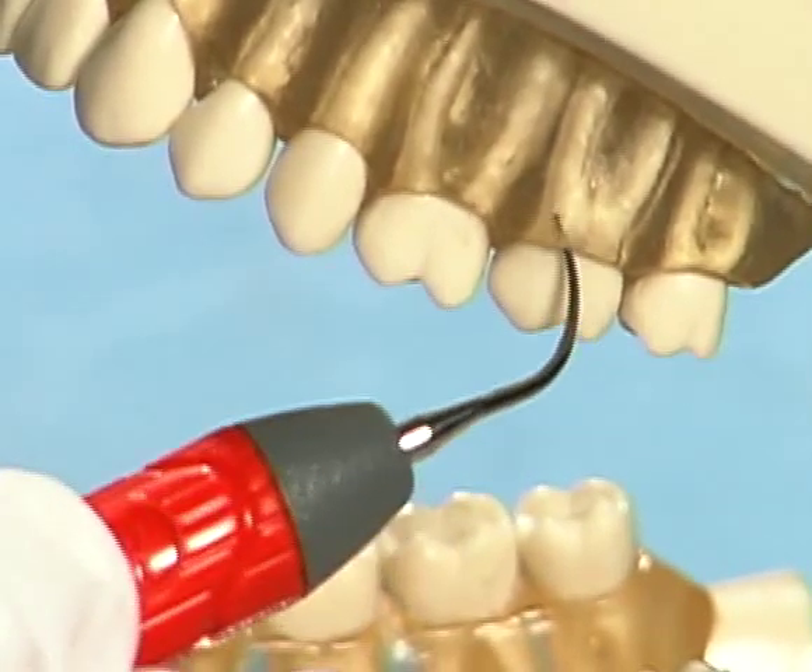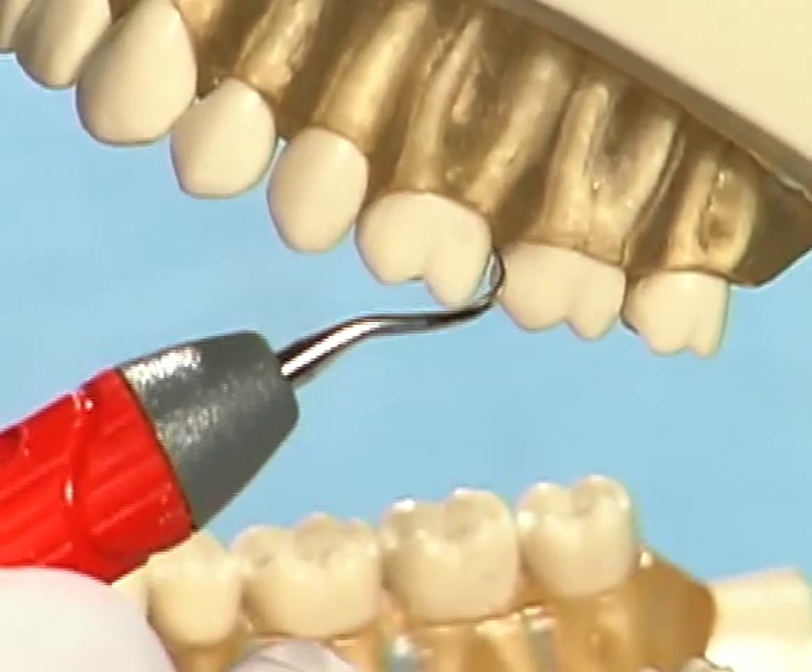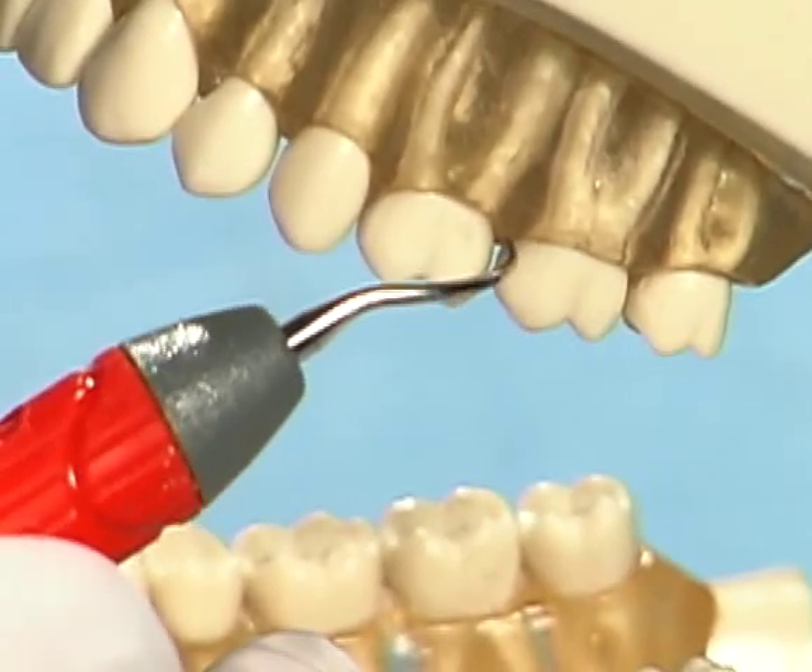The curved, slim-diameter right and left tips can be easily adapted to hard-to-reach areas such as the distals of second and third molars.